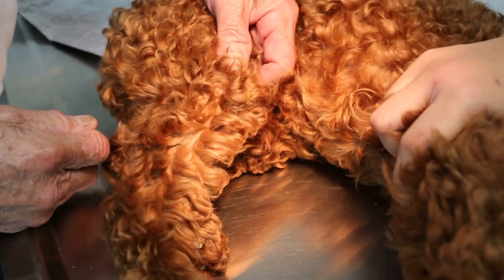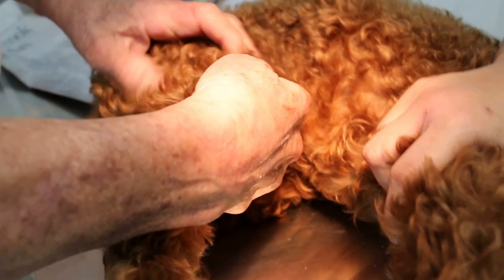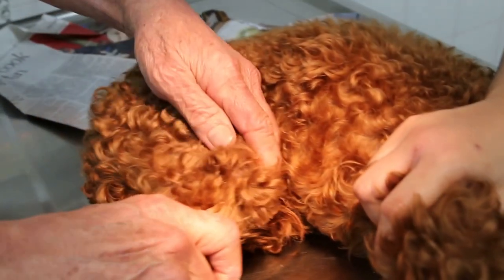Wait for fracture. No, but take x-ray first. Yeah, take x-ray. Then the other leg — the other leg is the same thing also. Do the lateral, the right side lateral luxation.